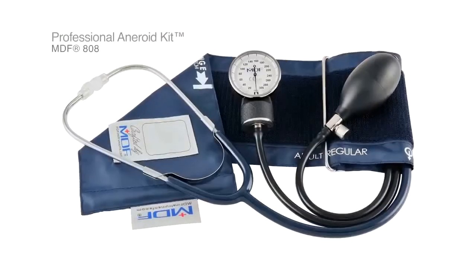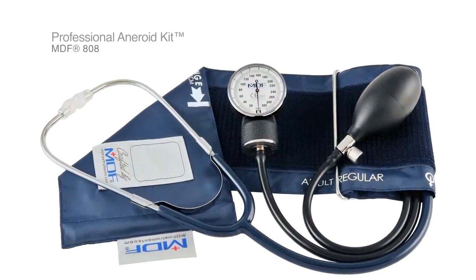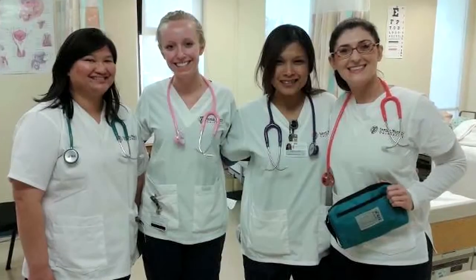A variation on our Calibra Pro is the professional aneroid sphygmomanometer with a single head stethoscope included. This is great for nurses, medical students, and medical assistants — really anyone who goes from patient to patient and wants the convenience of a complete set. It also comes with a D-ring cuff, so it makes self-measurement easier, making it ideal for the everyday home user.